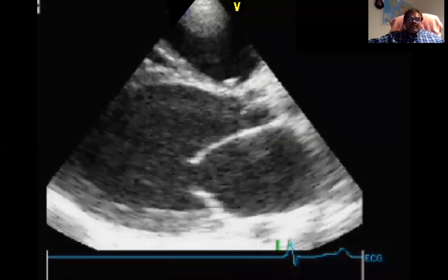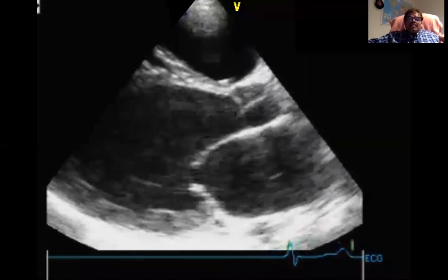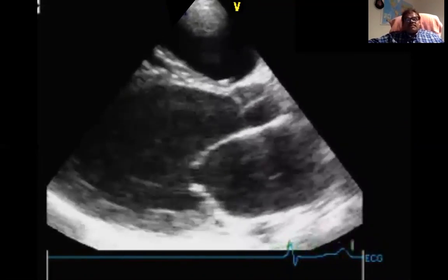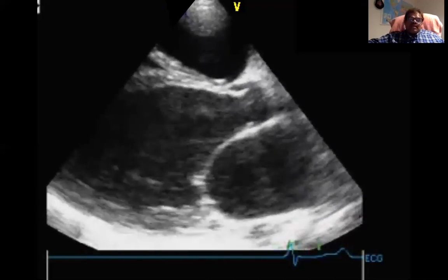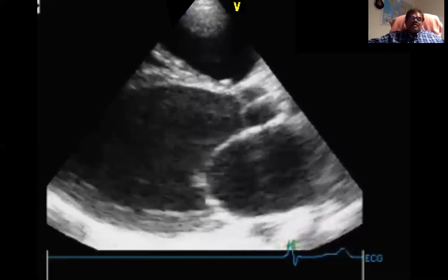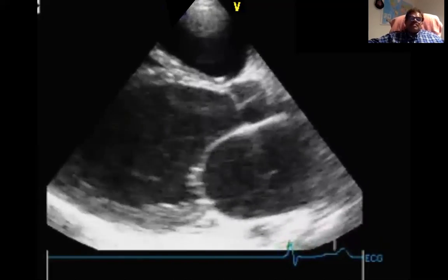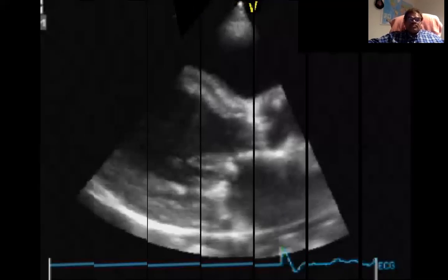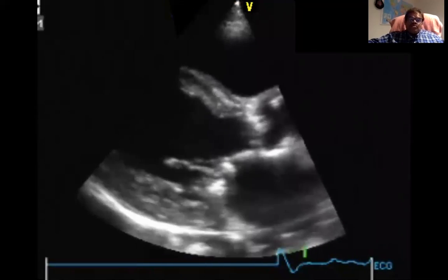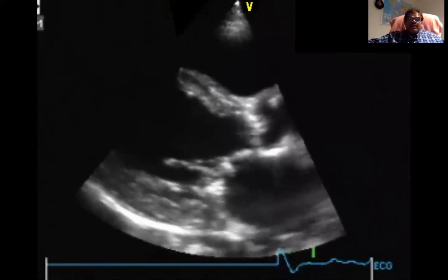But in case of a dilated ventricle, where usually the left ventricular systolic function is very poor, the anterior mitral leaflet cannot reach within 1 centimeter of the septum. In that case, you can say that the left ventricle is dilated, which can mirror that left ventricular systolic function is reduced. You can see here left ventricular systolic function is reduced, but there is restricted anterior mitral leaflet movement.